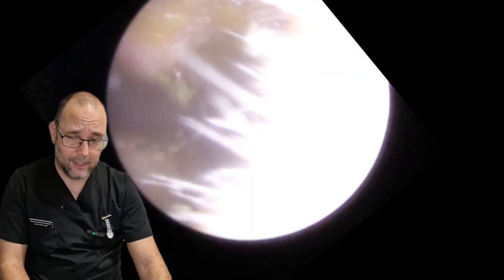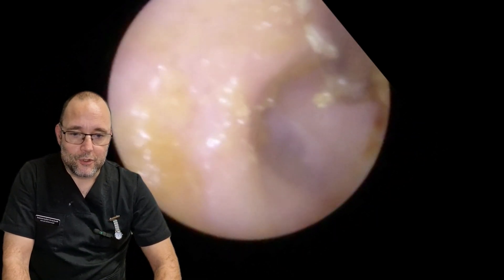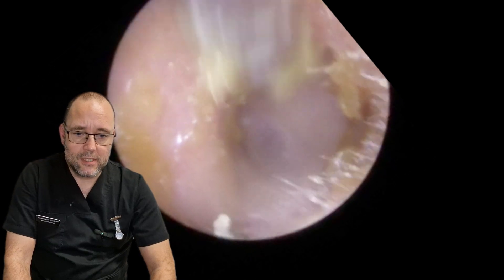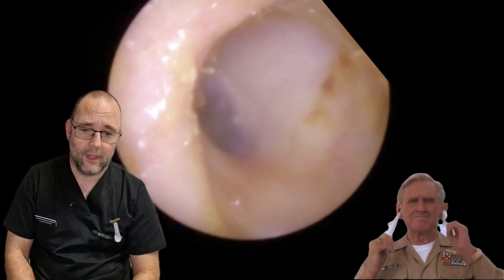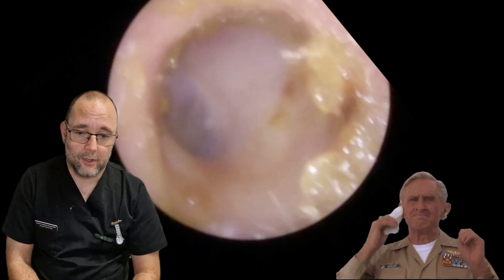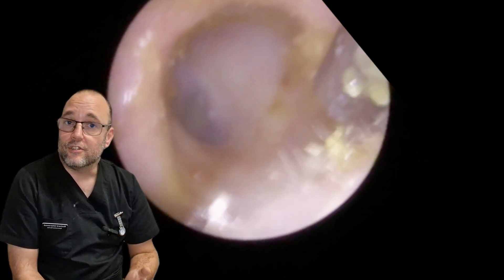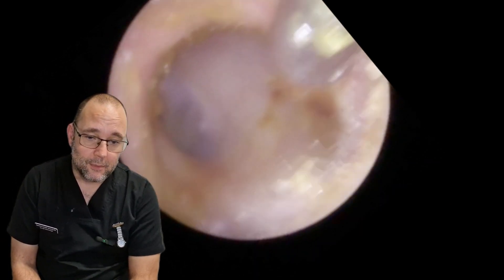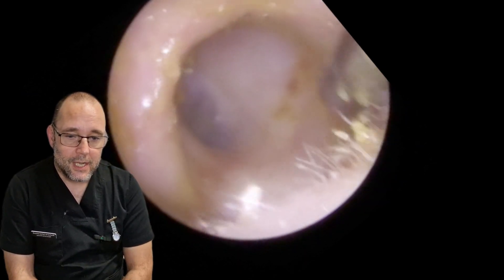You don't want to see a picture of what's in this tank after a busy day in the clinic, trust me, it's not a pleasant sight. What we're doing now is just mopping up around the edges — cosmetic really. It might delay things a little bit, less to stick to. You need a little bit in there because earwax is good for us — it can prevent all kinds of problems.